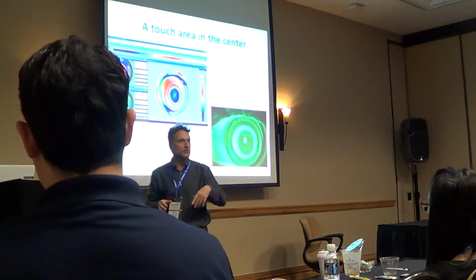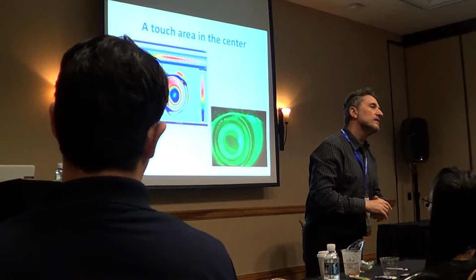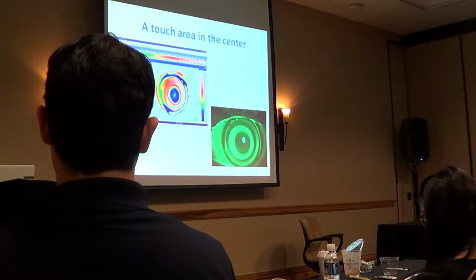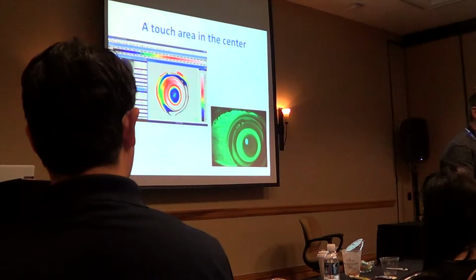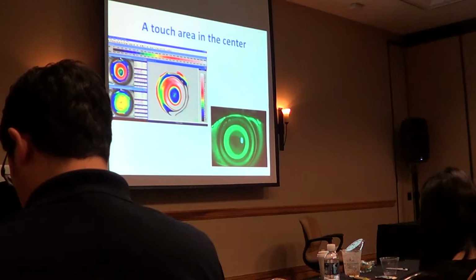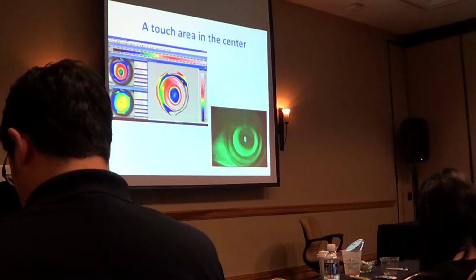Okay, I'm sure. So this way is fixed for what is called a pseudo central island. Pseudo, not the real central island. It is not true, exactly. Fake central island. Okay, John Longford created the patterns: smiley face, frowny face, lateral decentration, central island, and fake central island. This is a fake central island.